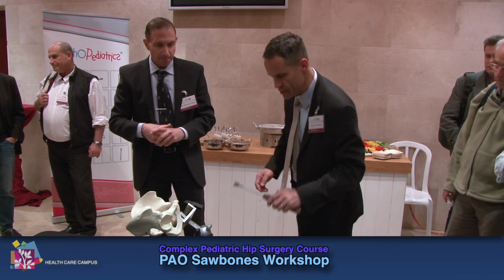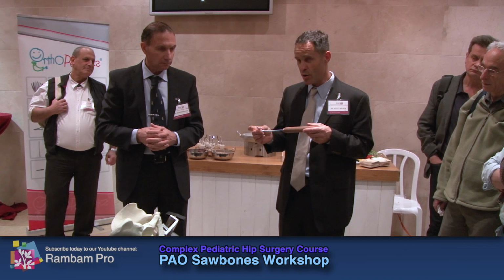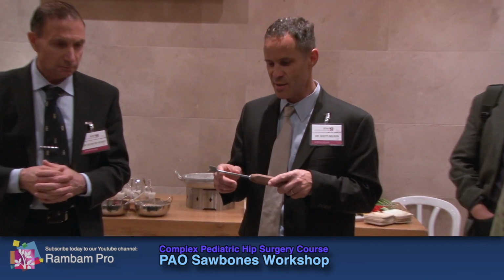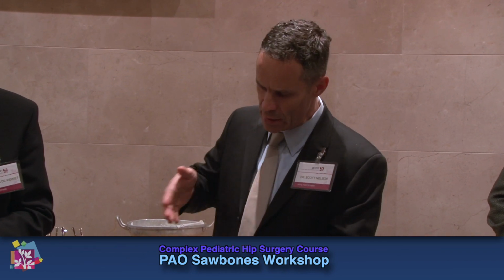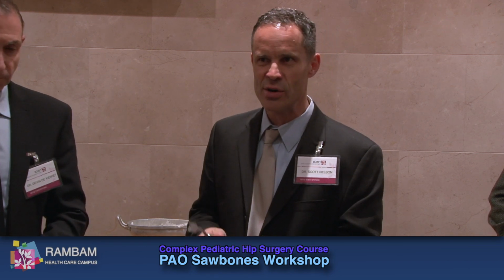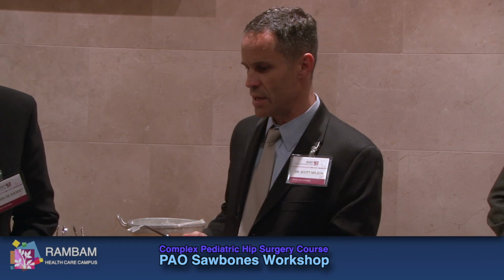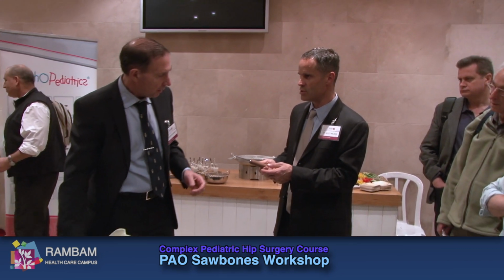One other comment, this osteotome here is a little different than the ones I showed in the pictures. When you're cutting hard bone with these osteotomes, some of the energy is going right out of this sharp corner right here, and those curved ones really help to transmit that energy into the end of the osteotome. So these ones, I don't know why they're still around, but they're just a little bit of an older style. Do you have a preference of using these over the other ones for anything?